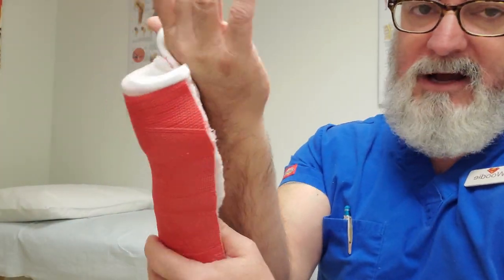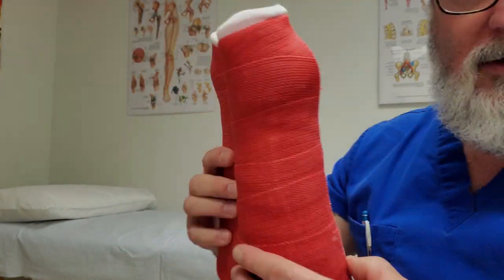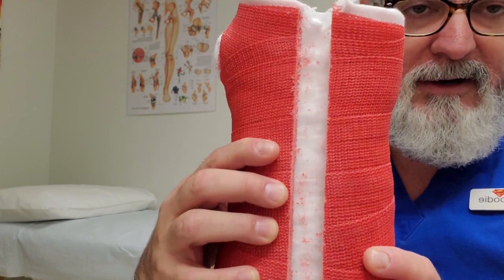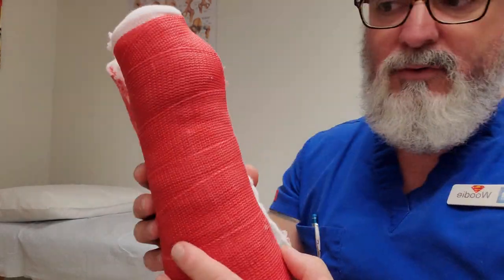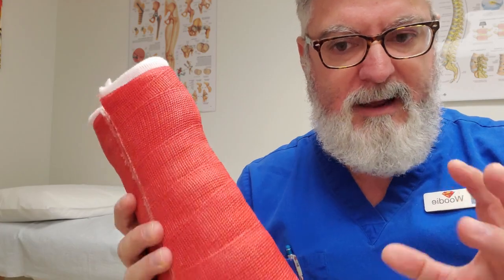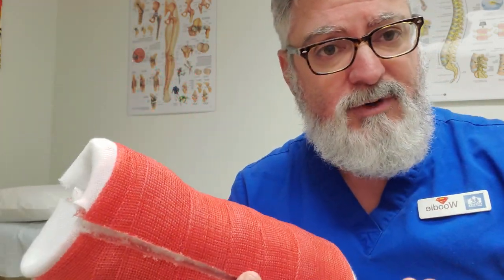As you can see, the cast comes right off. When operated correctly, not only did we not cut through the cotton, but we didn't cut through the stockinette either. When you're dealing with pediatric patients, this is super important — it really creates a nice comfort factor and a level of trust with the caregiver.